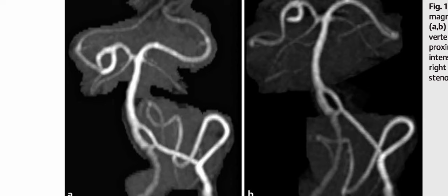Next is a 77-year-old man presenting with transient ischemic attacks and vertigo. These are the three-dimensional volume rendered magnetic resonance angiography reformations, and they are showing that there are two separate lumens at the vertebrobasilar junction, and the lumens converge proximally and distally. There is slight loss of flow signal intensity at the origin of the fenestration on the right, which corresponds to a region of focal arterial stenosis.